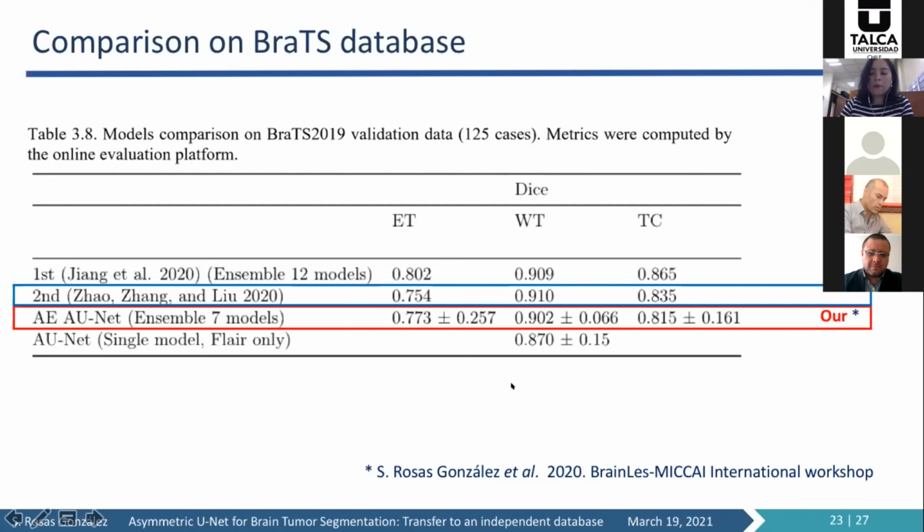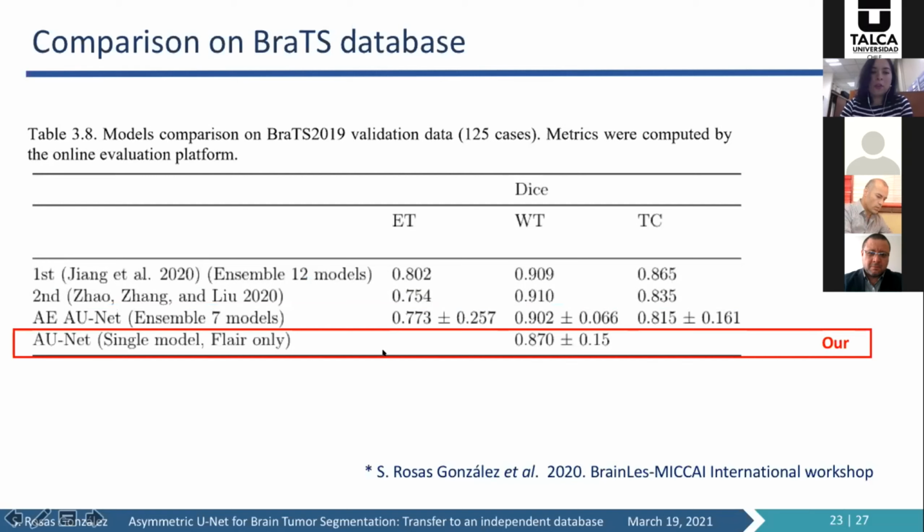And when we compare with our single model, using only the FLAIR modality with our asymmetric U-Net, we can see that we obtain a lower but acceptable performance in the whole tumor segmentation. Considering that this is a very competitive challenge, we can say that our model performed well.